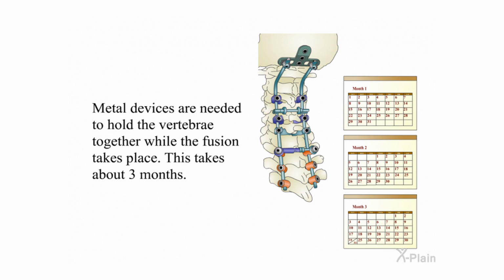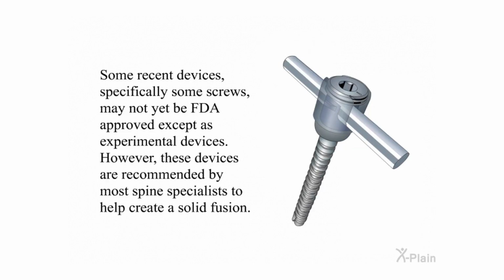Metal devices are needed to hold the vertebrae together while the fusion takes place. This takes about 3 months. Some recent devices, specifically some screws, may not yet be FDA approved except as experimental devices. However, these devices are recommended by most spine specialists to help create a solid fusion.